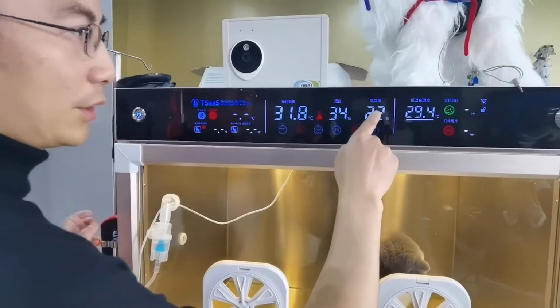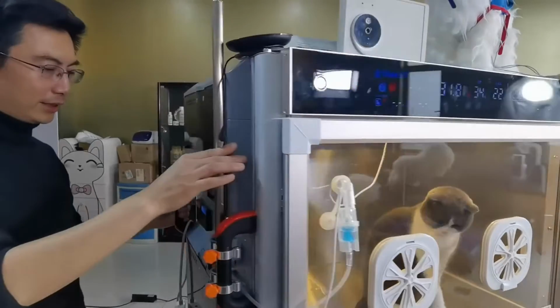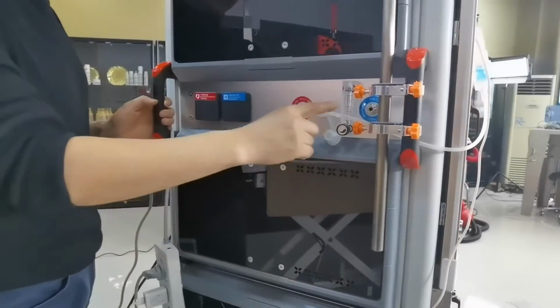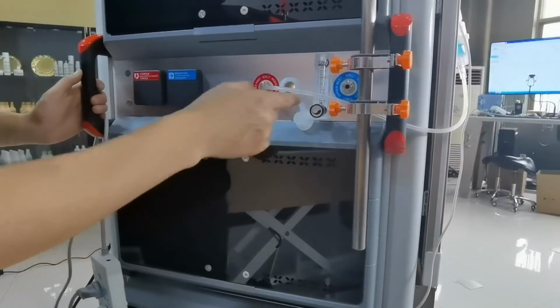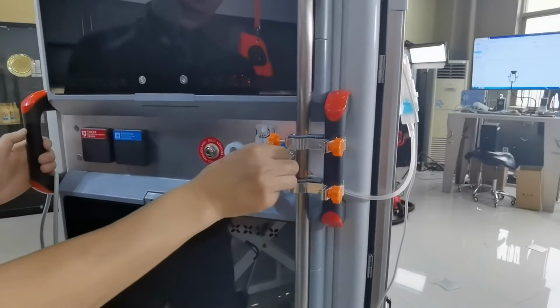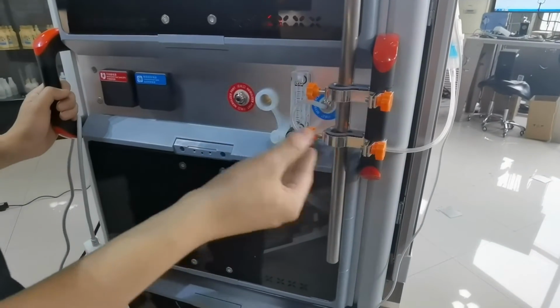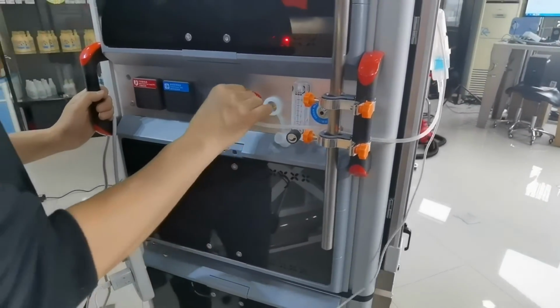That's the oxygen concentration control. As you can see, we have the valve and the gauge for regulating the airflow of oxygen into the compartment. And here is where the oxygen tube goes in. There's an oxygen inlet like this. Very simple. Plug in, and it locks automatically. And the other port is for the nebulizer. We'll talk about that later.